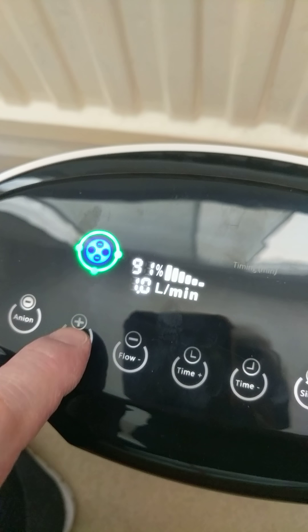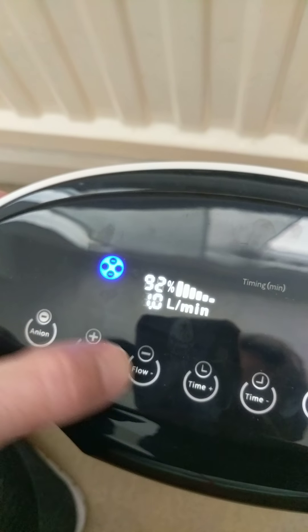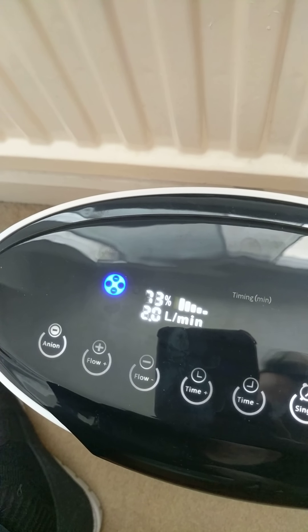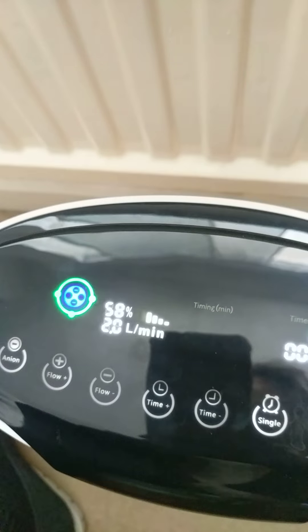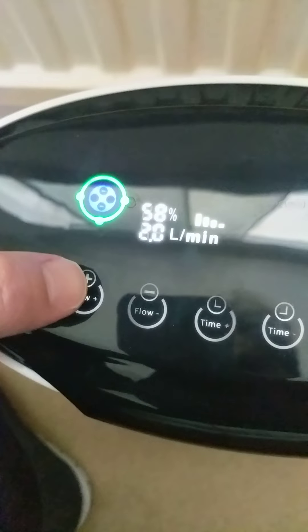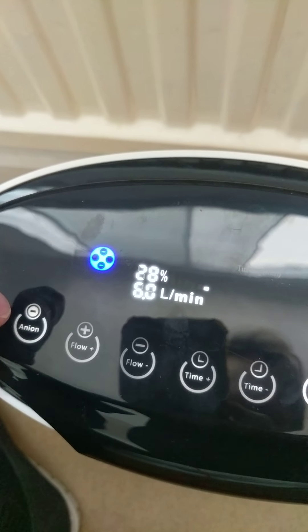It's one litre a minute, but if I increase the flow to two litres, that will reduce itself to 78, 73%, and now we've got a low oxygen alarm. So if you want a lot of oxygen it has to be only one litre per minute. I can increase the flow all the way up to six litres and the percentage of oxygen will go down accordingly to very low in fact.